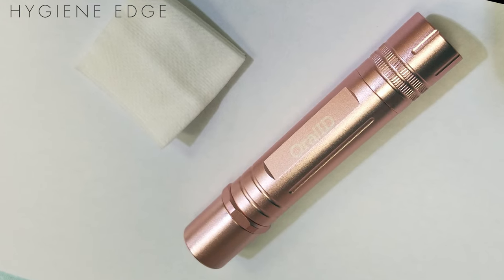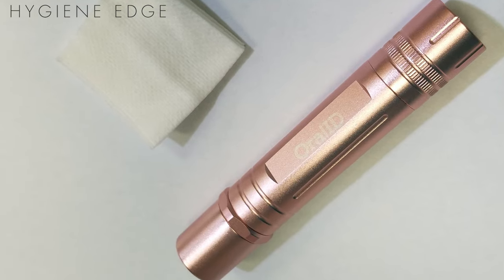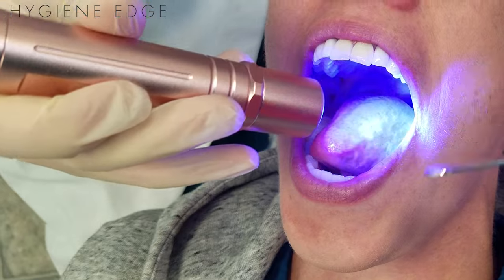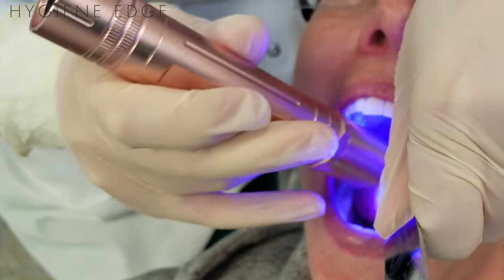The Oral-ID Light is an easy-to-use oral cancer screening device that helps spot suspicious areas that aren't easy to detect with the naked eye. To differentiate lesions, the clinician wears special yellow-tinted glasses as they evaluate the oral cavity.